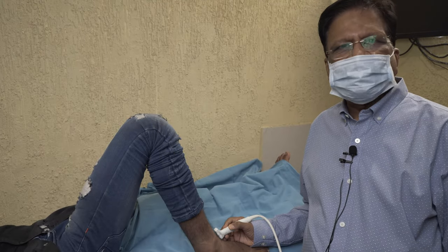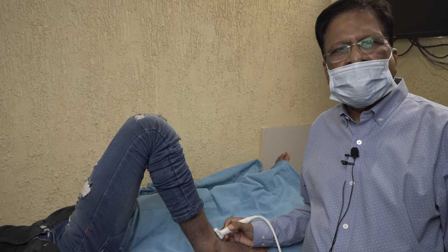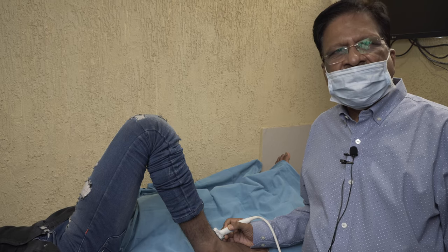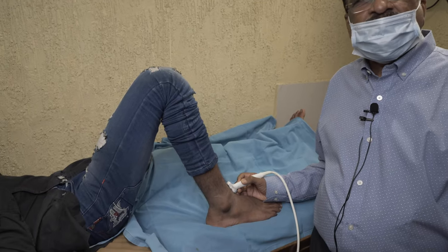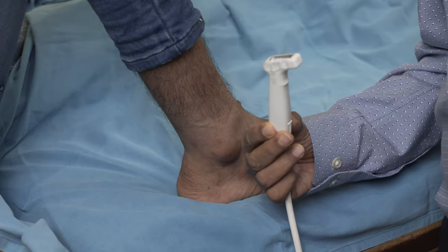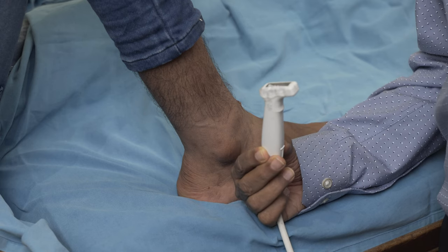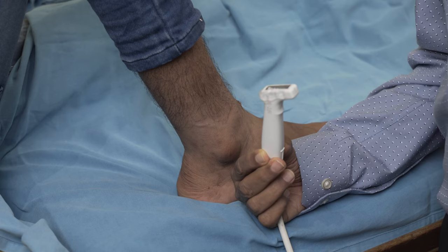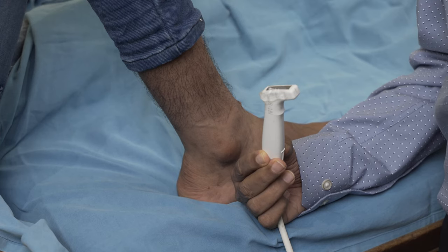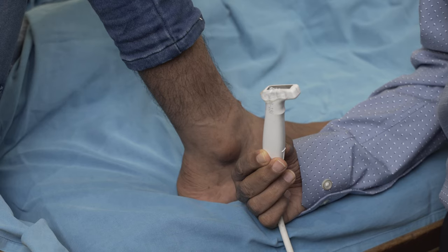Examination of the ankle joint can be performed by asking the patient to lie down supine on the examination table, or asking him to sit up with the knee being bent at about 45 degrees and the sole of the foot being flushed with the top of the table. Periarticular soft tissue structures of the ankle joint being relatively superficial, just a few millimeters deep to the skin surface, I prefer to evaluate these structures using a high frequency probe, ideally the hockey stick probe which ranges in frequency between 8 to 18 megahertz.